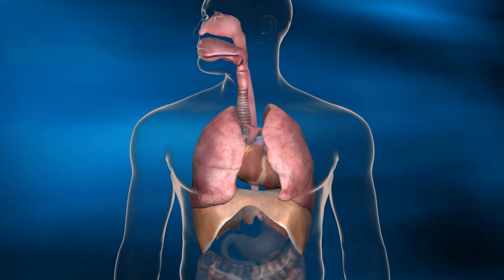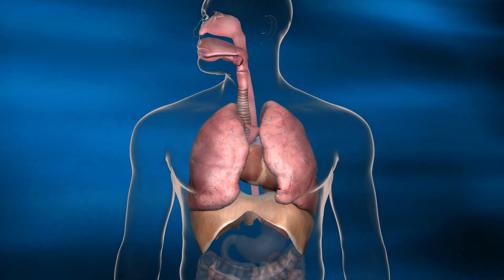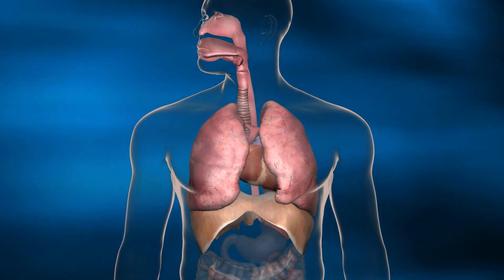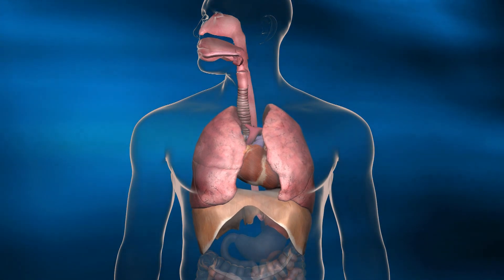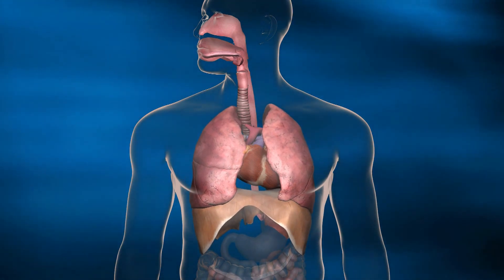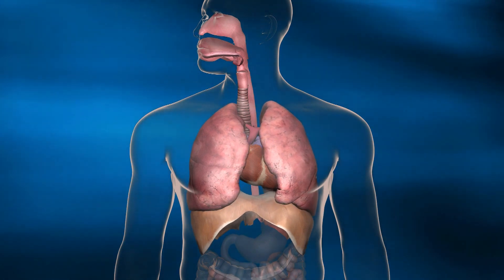Transpulmonary Pressure is a quantitative and direct measurement of actual pressure required to inflate the lung. Transpulmonary Pressure measurements aid the clinician in the management of critically ill patients and specifically in setting optimal PEEP and inflation pressures.